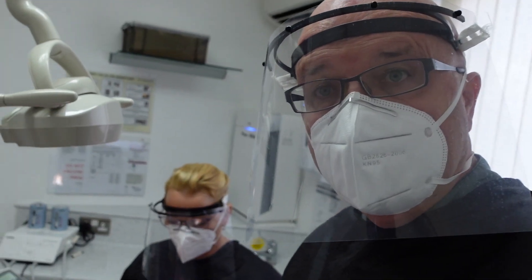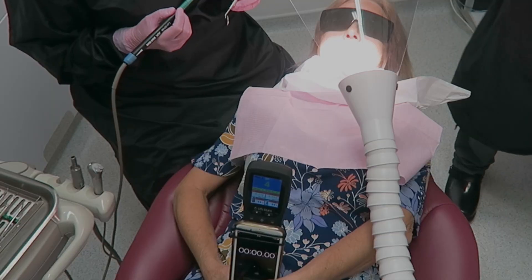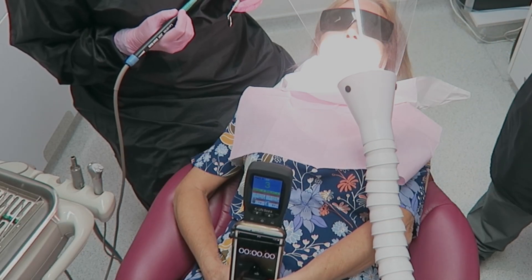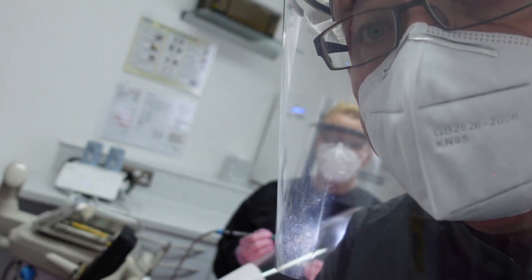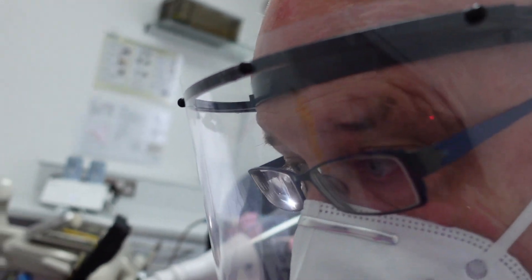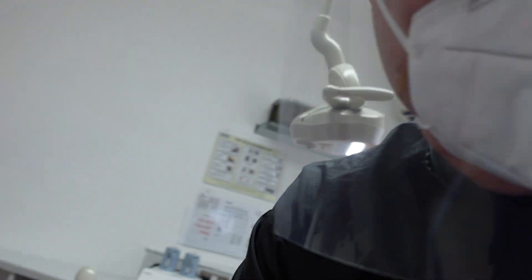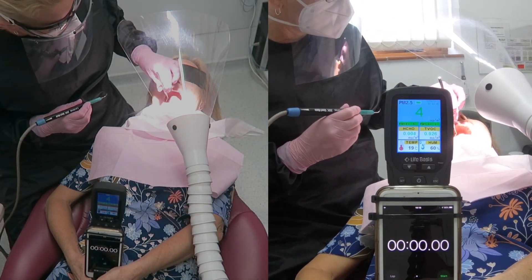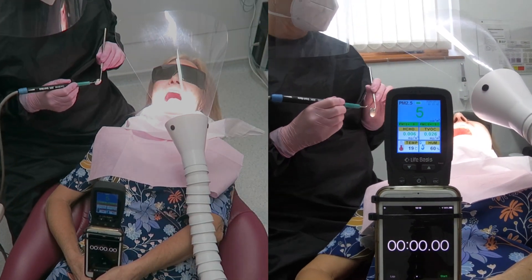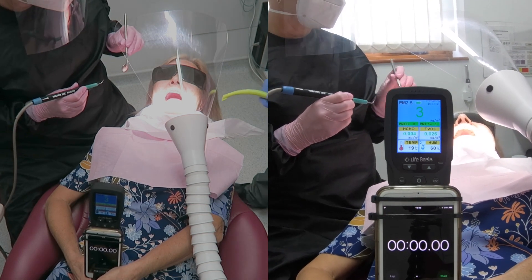Right okay, so I've got my PPE on. I'm just going to put the dental air into position, which I think it is already, so that's at a working height. And then we'll just crank that up to full power so I'll just bend down and we'll use a little remote control. Okay, particle readings are nice and low. The camera will still go okay.